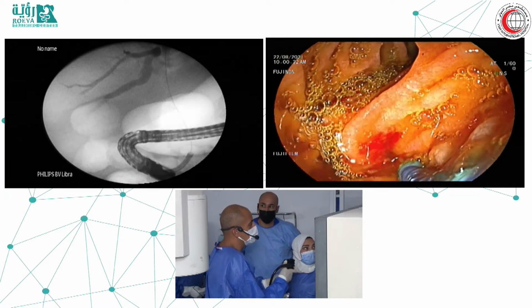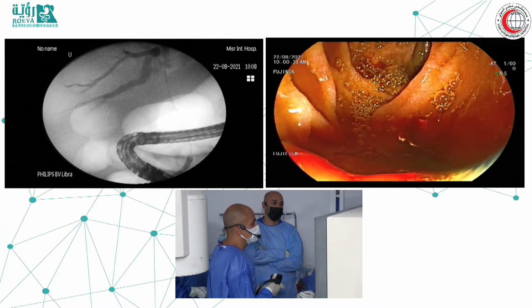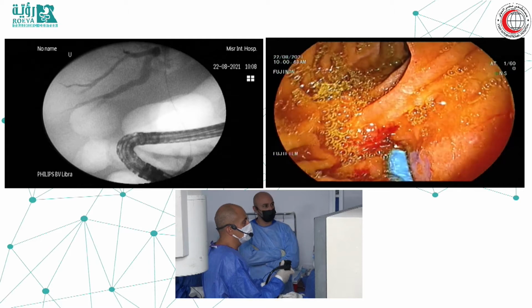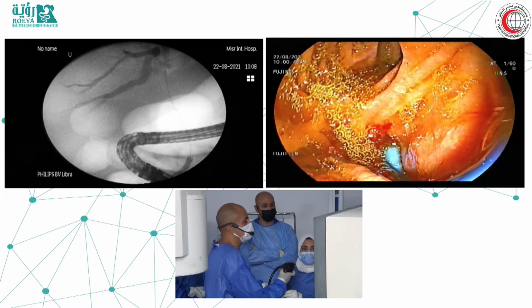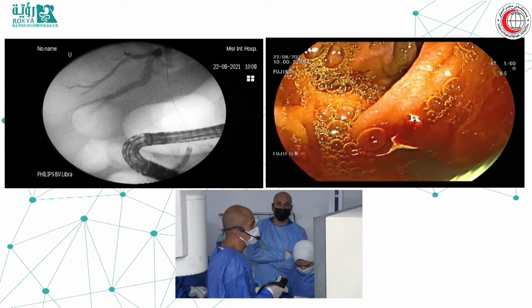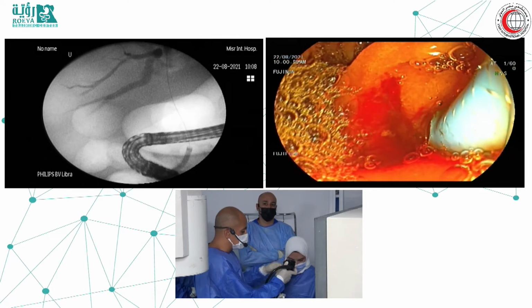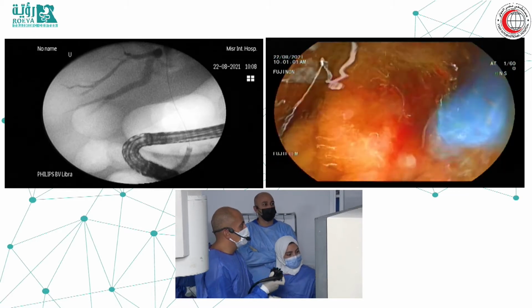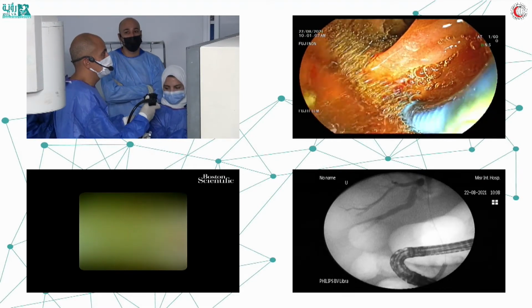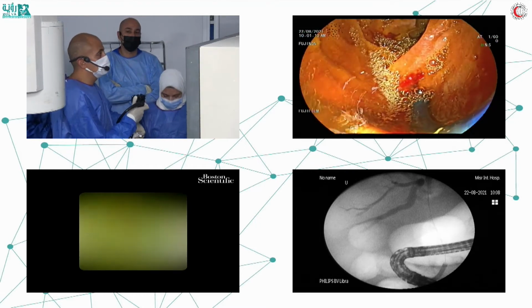My opinion, yes. I know that this will be coming soon to the cholangioscopists. I think yes, if we can see a stricture and then just push on a button to assess the type of the stricture, and then our AI will guide us to the best part to take a biopsy. I think this is a very good example. Yeah, I would love to have it. I think it's a perfect application for AI here, because we really need something to help us, because our eyes alone are not good so far to differentiate.